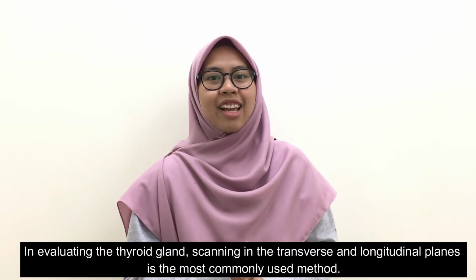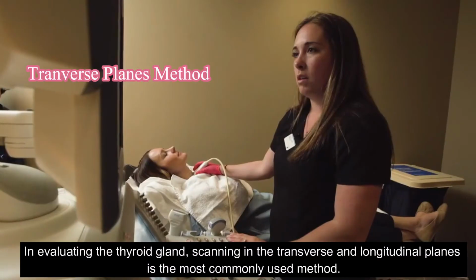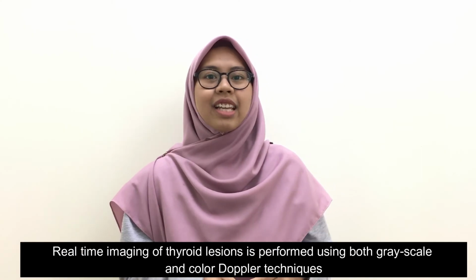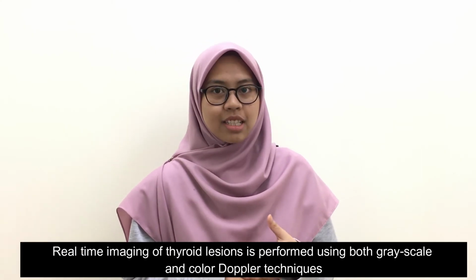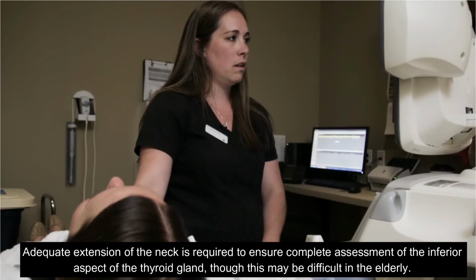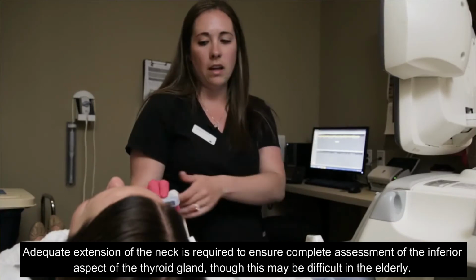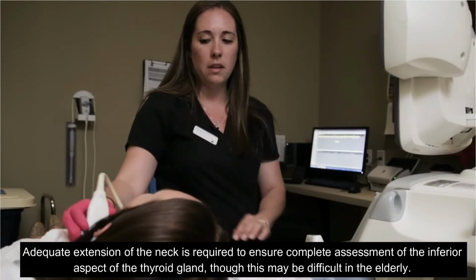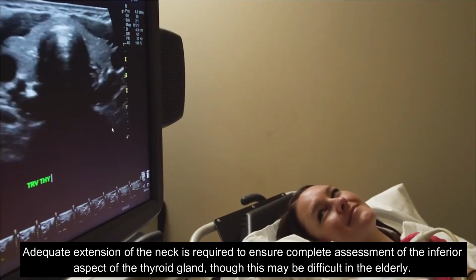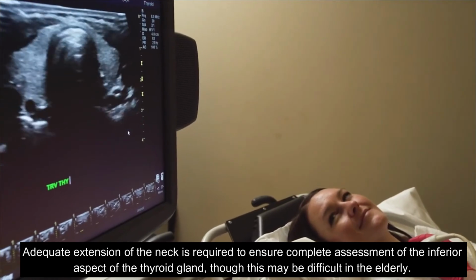In evaluating the thyroid gland, scanning in the transverse and longitudinal planes is the most commonly used method. Real-time imaging of thyroid lesions is performed using both grayscale and color Doppler techniques. Adequate extension of the neck is required to ensure complete assessment of the inferior aspect of the thyroid gland, though this may be difficult in the elderly.